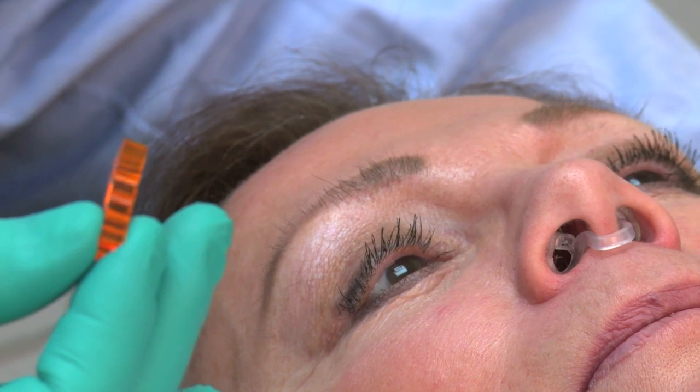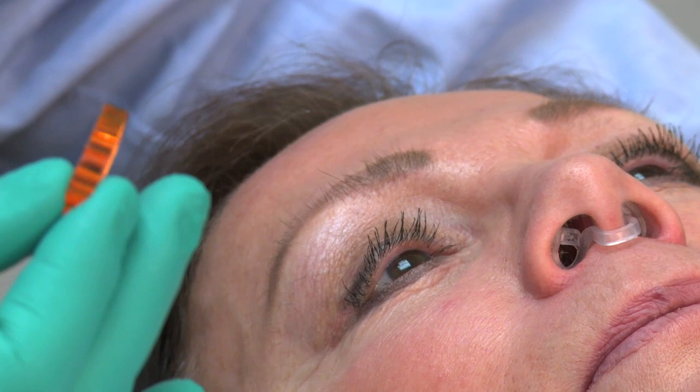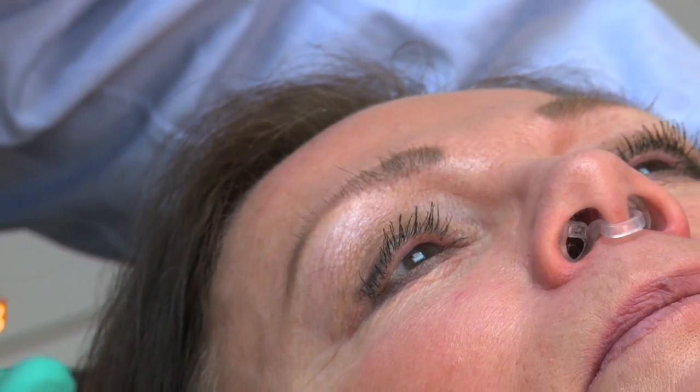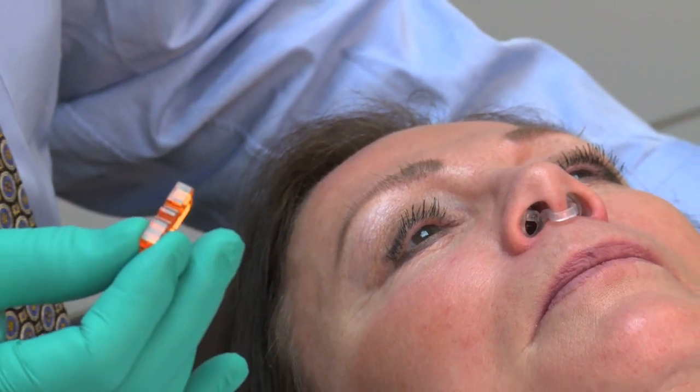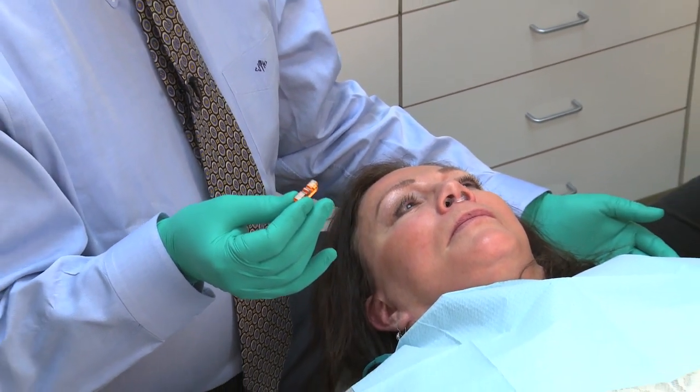So we've shown them how important nasal breathing is as compared to mouth breathing, because if you look at the literature, we know that there are multiple articles that support the fact that if you're a mouth breather, it actually makes your sleep apnea, your OSA, worse. So we want to encourage nasal breathing to assist us in having our appliance do the best it can possibly do for the patient. Once again, less is more. You don't want to have so much vertical that the patient cannot get their lips together, because we want to ensure lip competence so that they are nasal breathers and not mouth breathers.